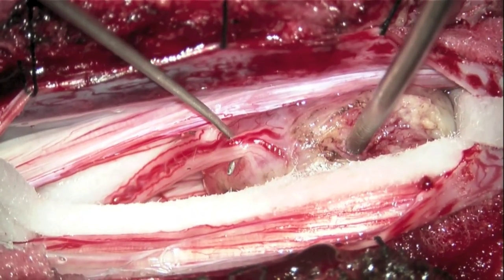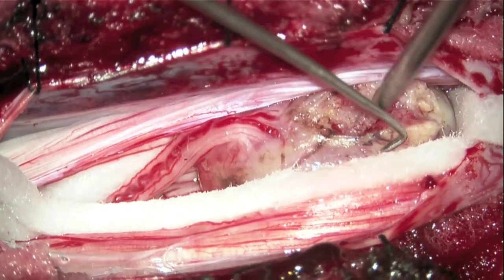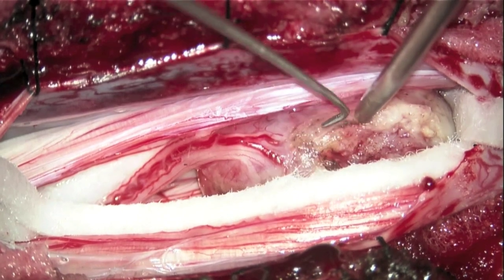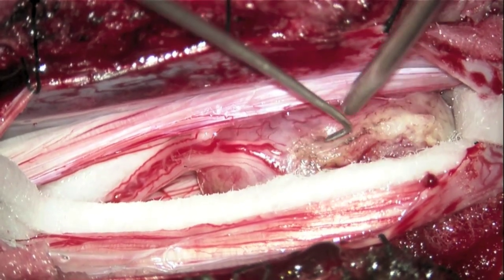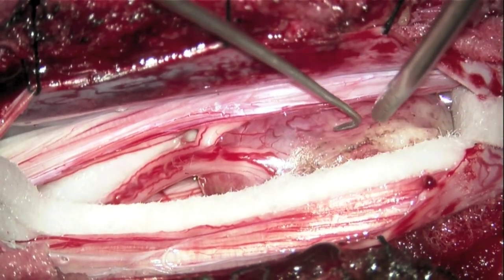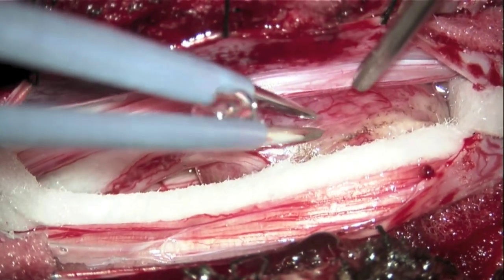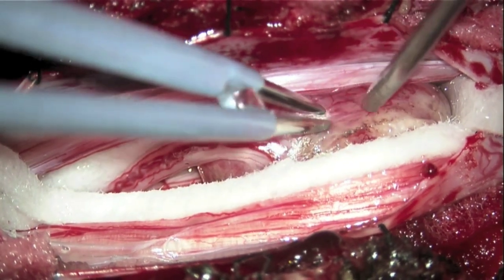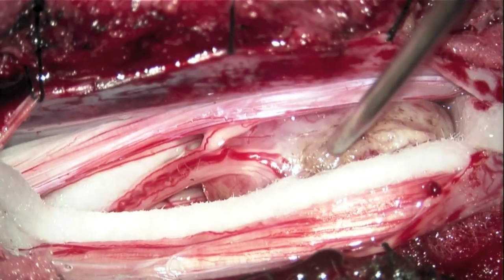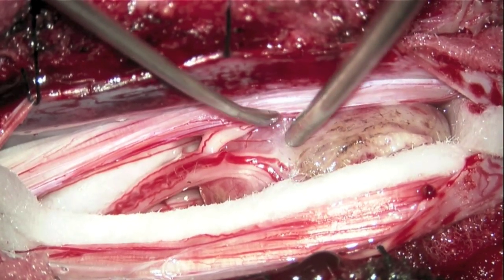The tumor nerve root of origin is dissected further and mobilized off the tumor capsule. Internal decompression allows greater mobilization of the tumor into the narrow dissection field. Irrigating cautery progressively shrinks and devascularizes the tumor. It is important to periodically assess the location and course of the functional corresponding nerve root on the tumor capsule.